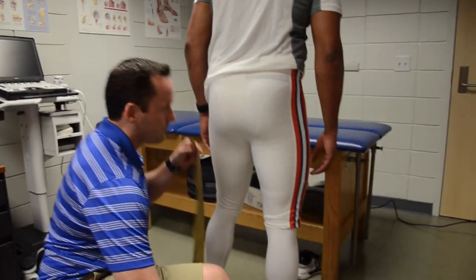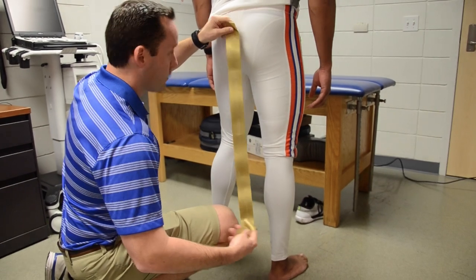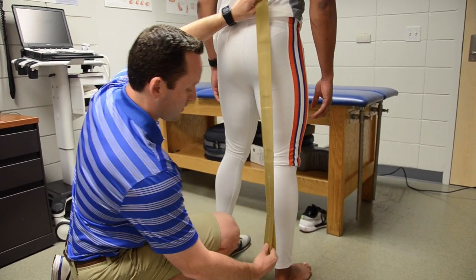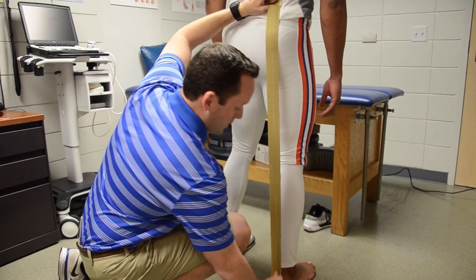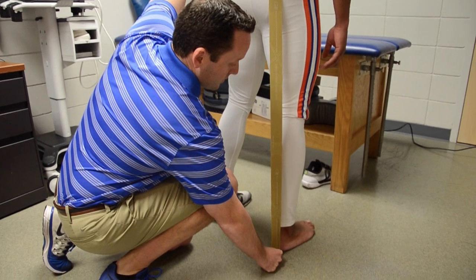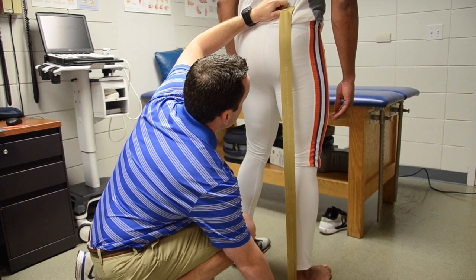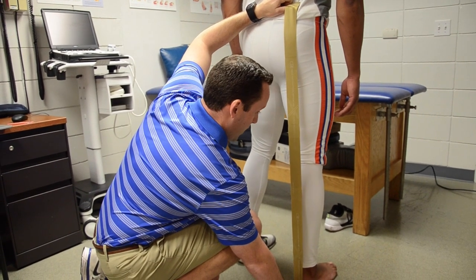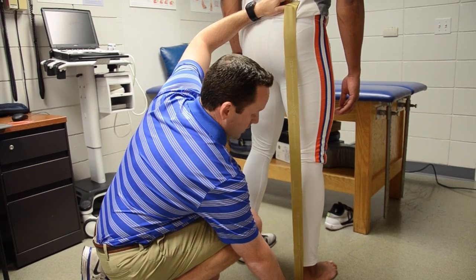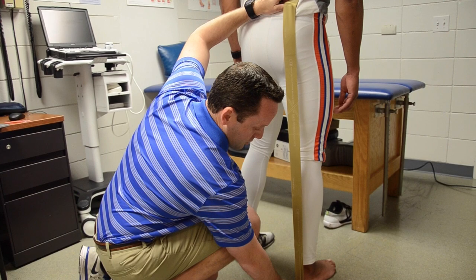So what we do first is we'll actually get to size the athlete up. Got to loop your finger through both sides here. You want to cut a length that actually creates some tension — you want a good amount of tension on this, otherwise it's not going to help the hamstring. This is to get guys back from a hamstring strain and get them practicing a little bit earlier. It kind of adds and takes off the load from the hamstring. You just get the tension, size it up, because you're going to want to go under the heel.